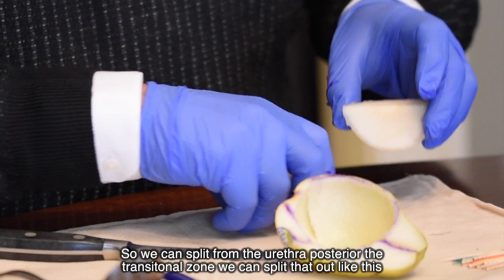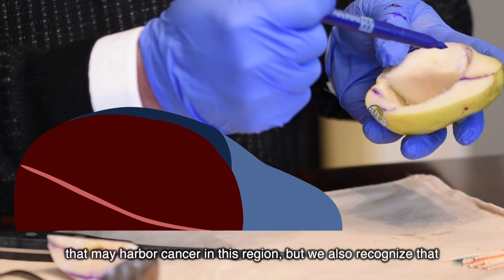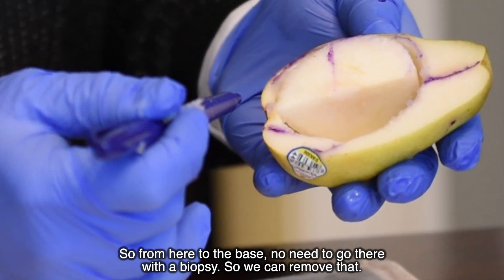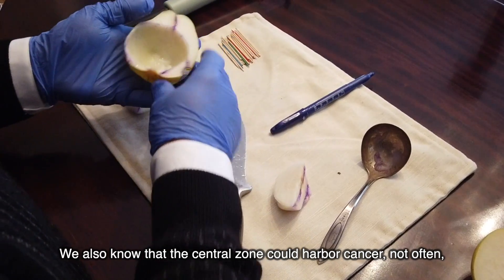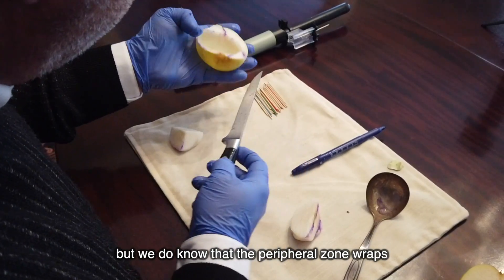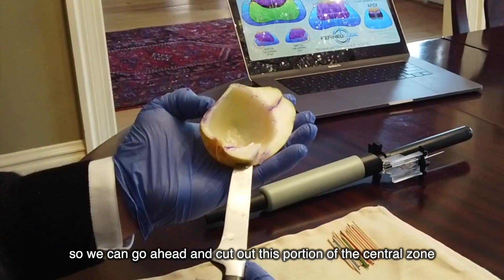We can split out the posterior transitional zone. The anterior prostate — including the anterior fibromuscular, peripheral zone, and transitional zone — may harbor cancer. However, the basal half of the transitional zone almost never harbors cancer, so from the midpoint to the base there's no need to biopsy there. We also know the central zone could harbor cancer, but not often enough to needle on a routine basis. The peripheral zone does wrap around the base at the lateral aspect.